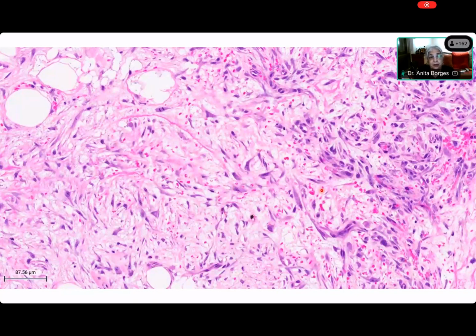Look at the stellate cells. Anybody has an issue with stellate cells, please note that the cells may have long processes and they're also in mitoses, but look at the shape of the nuclei. The shape of the nuclei is very irregular and the cells also have got multiple poles to the nuclei. So please, this you have to imprint in your minds as being stellate. There is huge numbers of stellate cells.